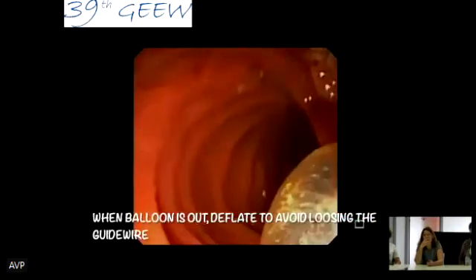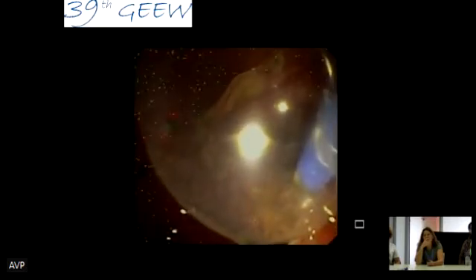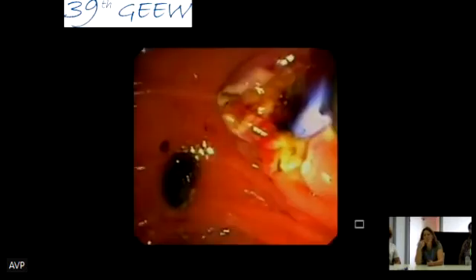And here you will see that we have to deflate. Here we didn't deflate quickly enough, and then we lost the guide wire. So we'll have to cannulate again, which is okay since he has a sphincterotomy here. But it's very important to follow the movement to deflate.